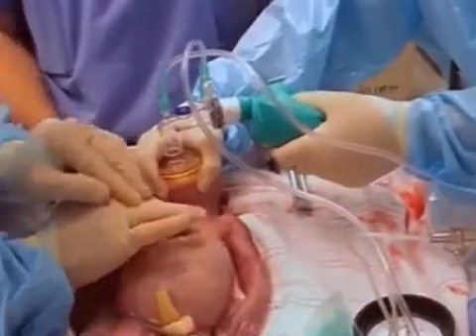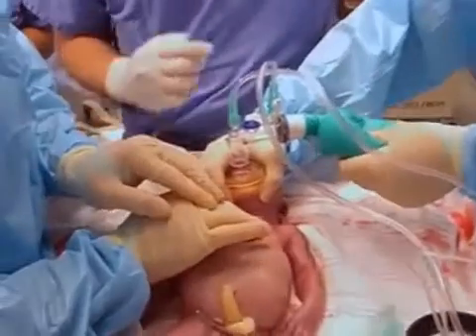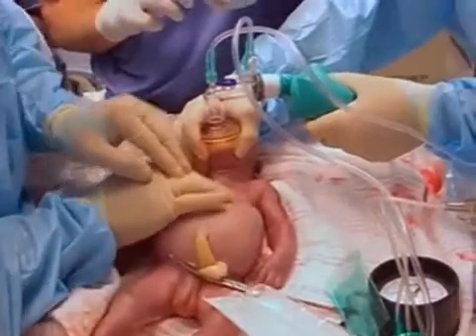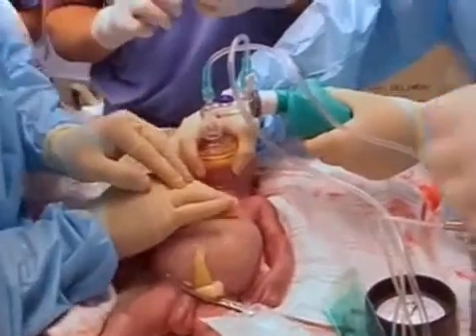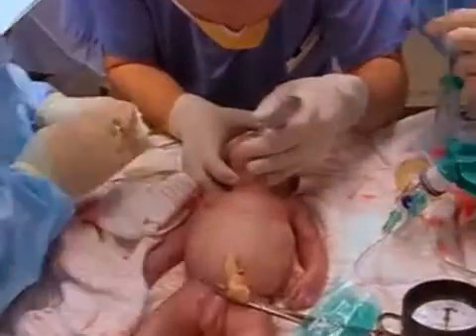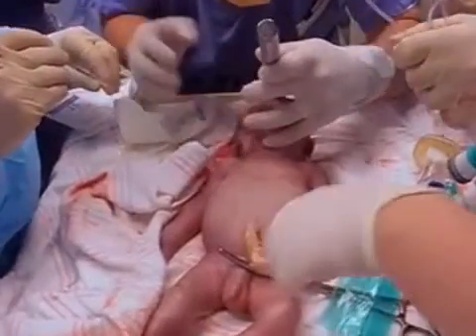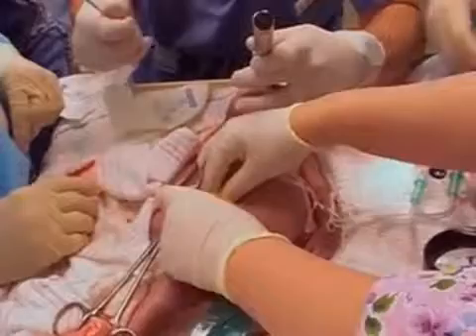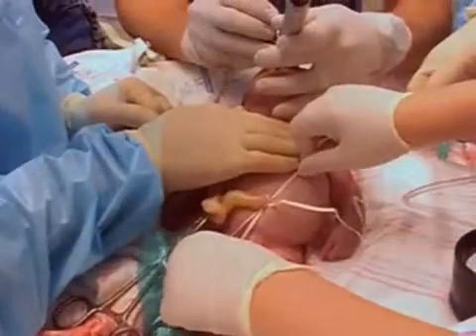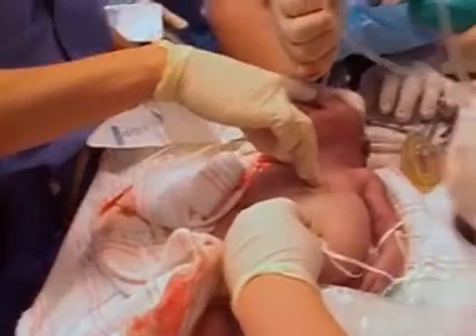During an extensive resuscitation, it may be necessary to obtain emergent intravenous access. Immediately following birth, the umbilical vein is the vessel of choice. The procedure is altered slightly from what has been previously described. Prepare the umbilical cord with an antiseptic solution. It is often impossible to create a sterile field in an emergency situation. The operator should don sterile gloves and keep the catheter as sterile as possible. The catheter must be pre-flushed and attached to a stopcock and syringe.